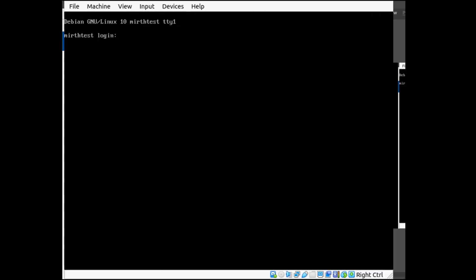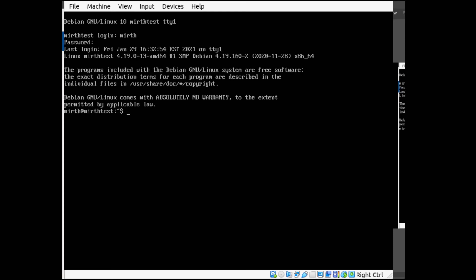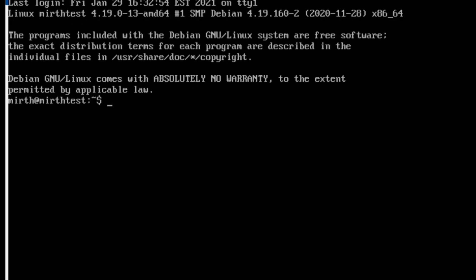Okay, so now it's just rebooted. So we can log in as the user MIRTH with our password for MIRTH. What we want to do is /sbin/service mirthconnect status.